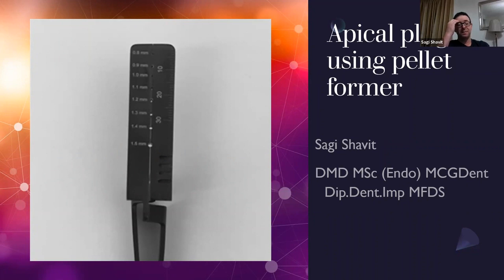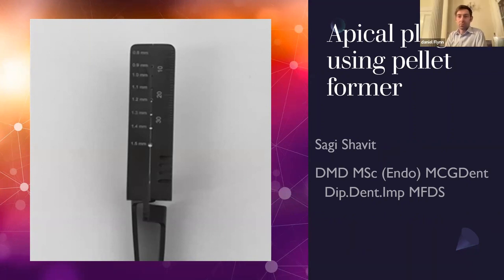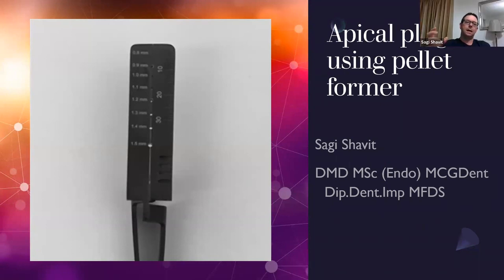I had the MAP system, which I wasn't very happy with for various reasons. It just didn't work for me. So I started creating my own silicone, through small silicone pellets. But again, it didn't work as well. So I decided to do something about it. I never liked MTA to start with, so I used bioceramic and Biodentine throughout my practice.